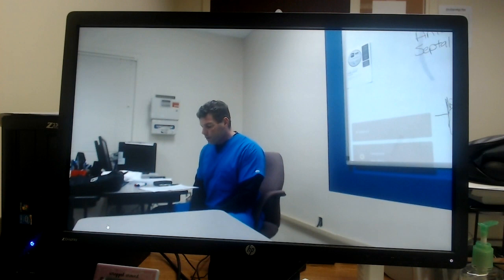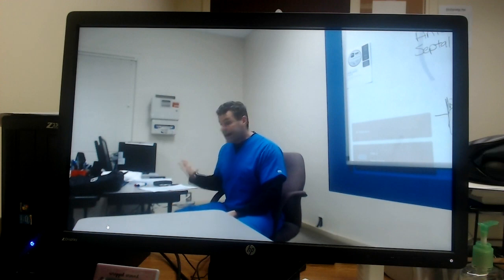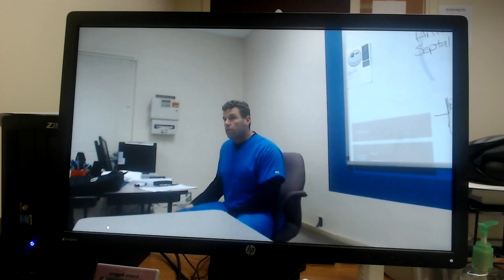A constant PR interval of 0.28 seconds indicates which of the following types of heart block? Remember, the PR interval normally is going to be 0.12 to 0.20. So if it's 0.28, that's more than 3 to 5 boxes, more than 0.2. So that's going to be what? Now, second degree is not consistent. A constant PR interval, that's A, first degree heart block, good. Remember, first degree heart block looks okay other than having a longer than normal PR.